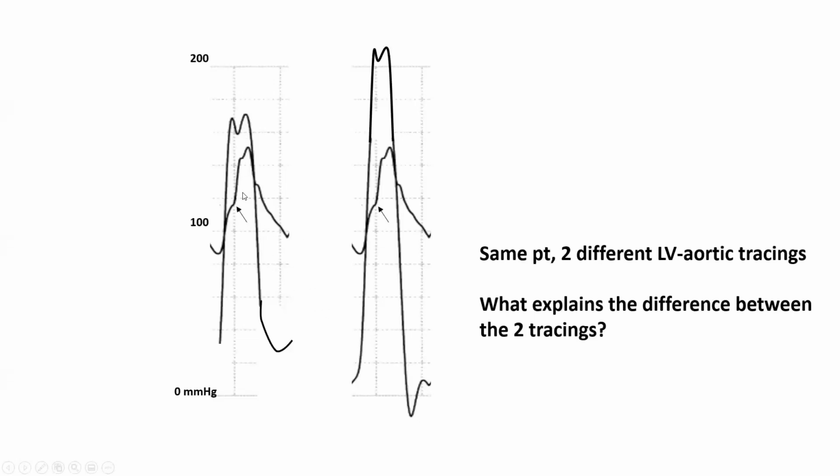So what's the error here? Anybody knows? What's making us have that difference in recording? Anybody? All right.